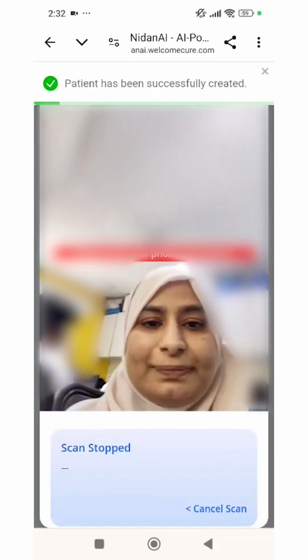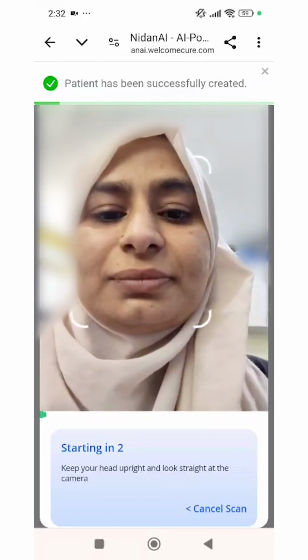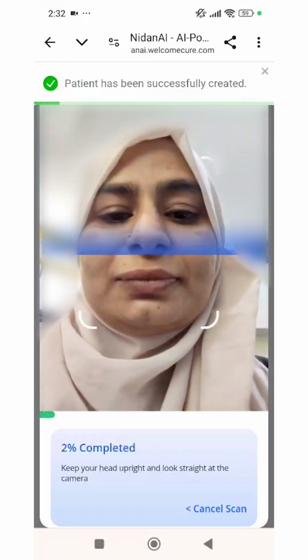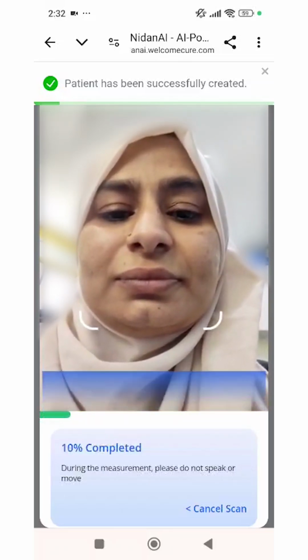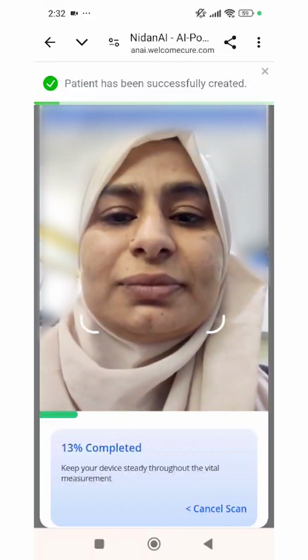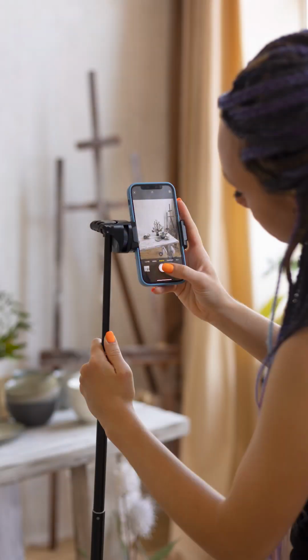The phone is ideally kept perpendicular and, most importantly, prompts the patient to maintain the right distance from their face. It could be held by the patient with their own hands, or could be done via a tripod kept on a table or on the floor with the appropriate height reaching the patient's face.